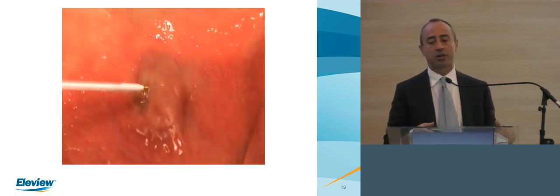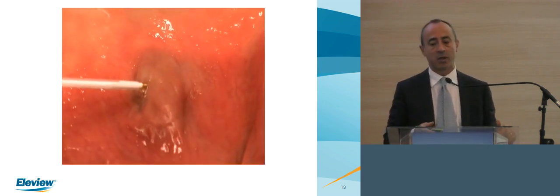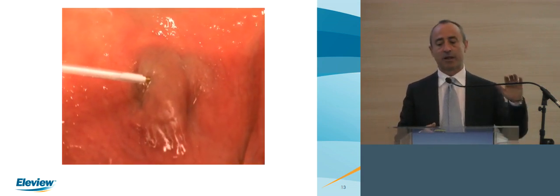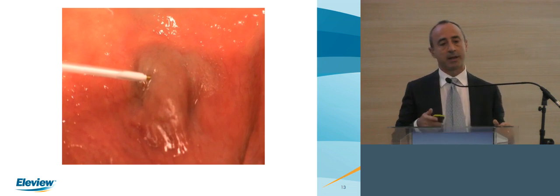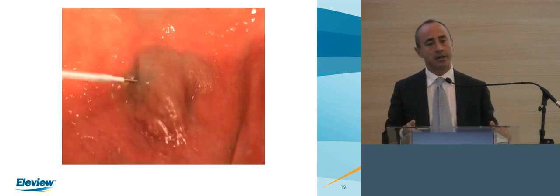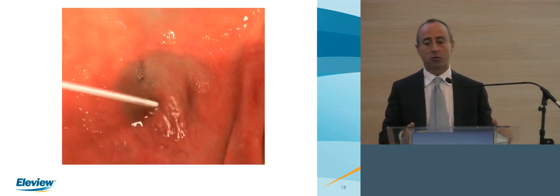So this is the first ever injection that we have done. This is a historical video we have done in our unit testing the solution.